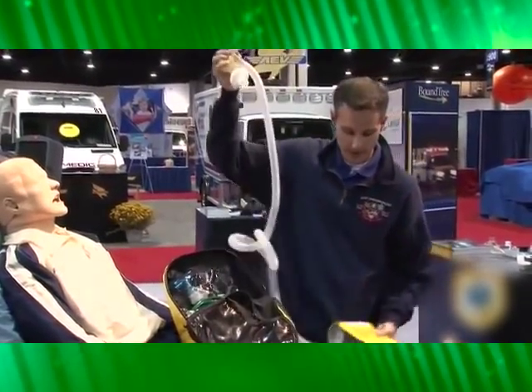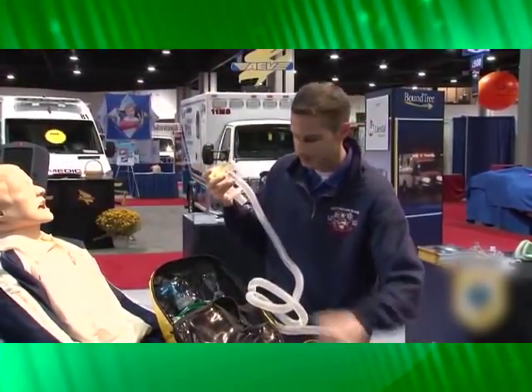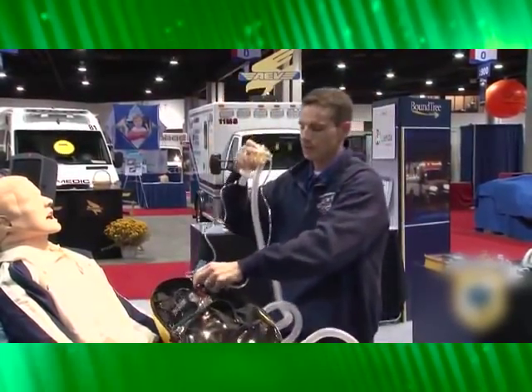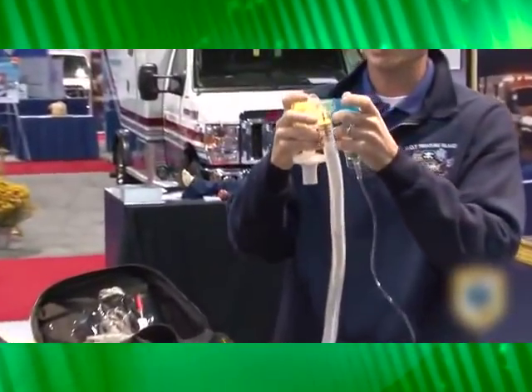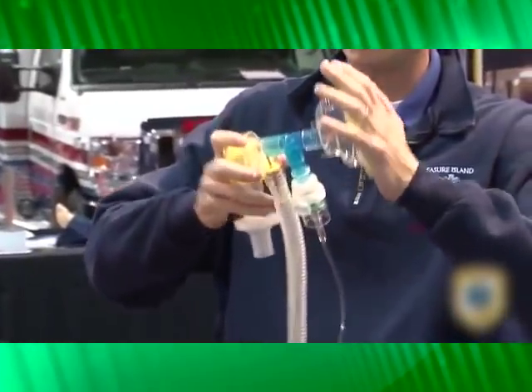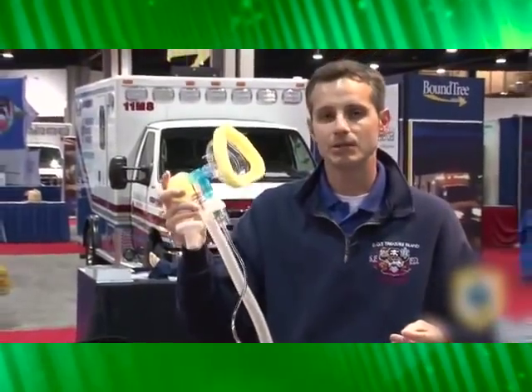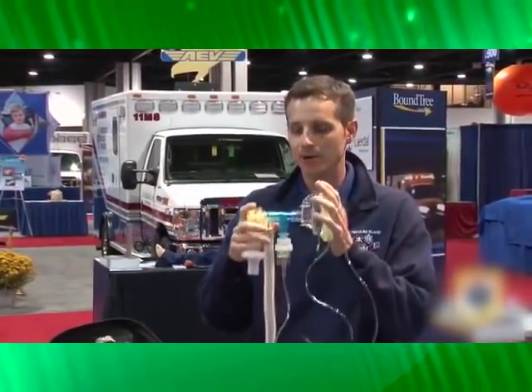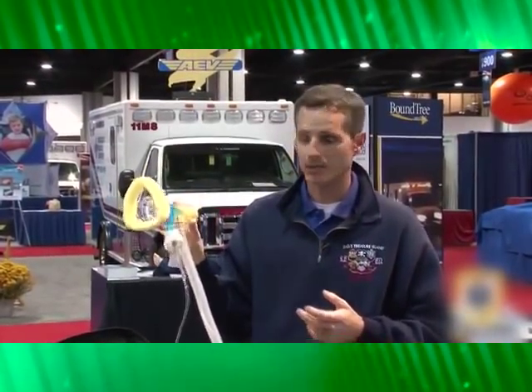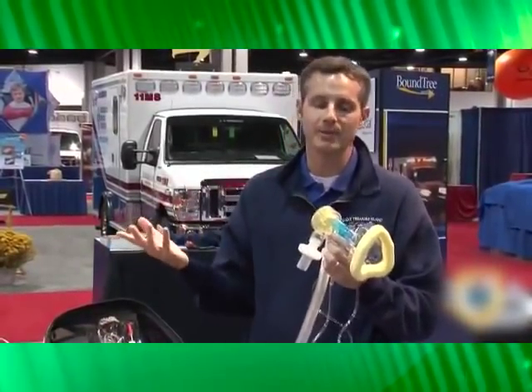In addition, you also have the ability to run an inline nebulizer in the system. You can take a standard T-piece nebulizer and attach it between the mask and the circuit, which gives you a very effective driveline for your albuterol. This is really effective for patients with COPD and asthma when you need to get albuterol in and their airway is already closed up. The filter is also filtering out excess albuterol from the back when they exhale.